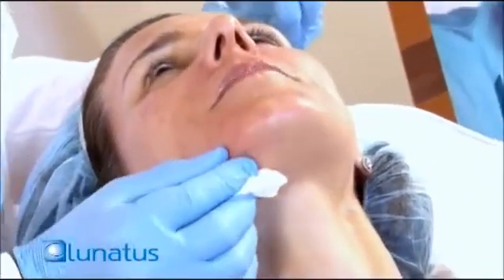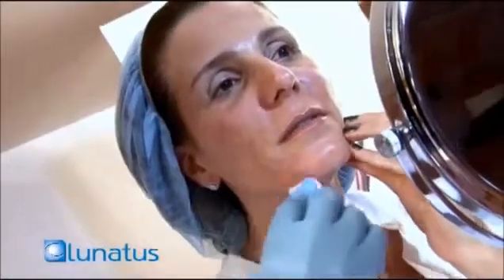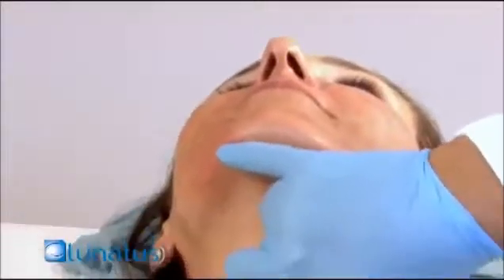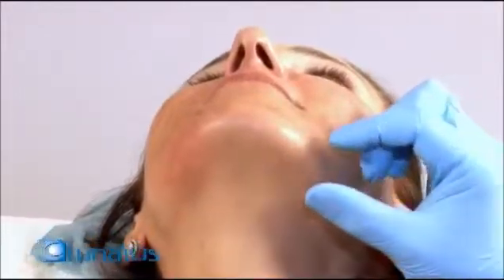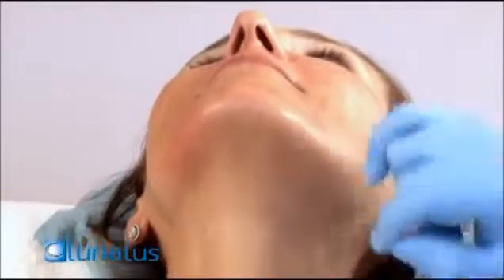I'd like to assess her, and I believe she also likes to assess herself, so let's have her sit up. Looking at the results, it's become much sharper now. It's starting to be deeper and goes together more harmonically. Over here there is a defect on this side compared to the other — it might be difficult to assess because of the shadowing, but you can definitely see that defect which we're going to try to correct.